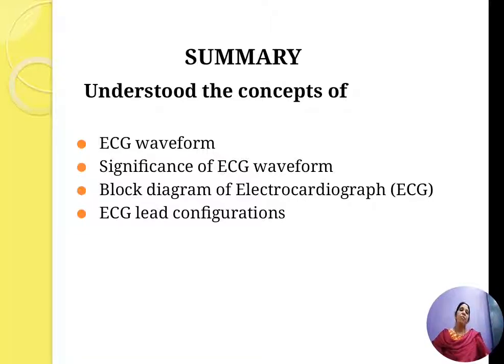So what is the important significance of the ECG waveform? It gives the details of the state of the heart. Any deviation of the waveform indicates arrhythmia, that is disturbances in the heart rhythm.